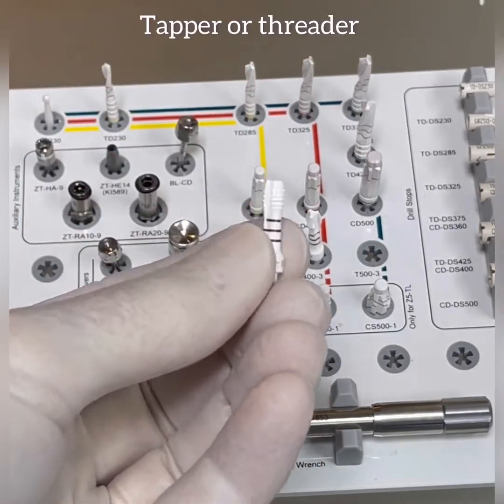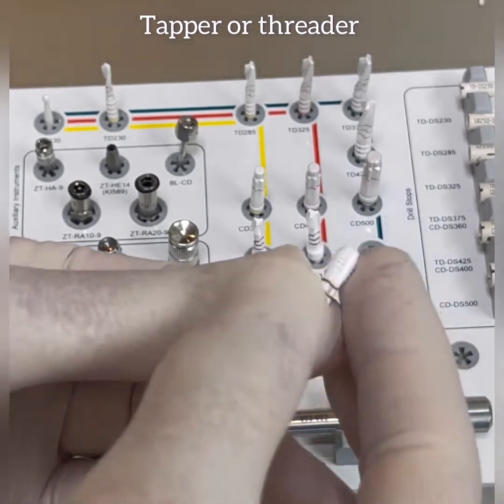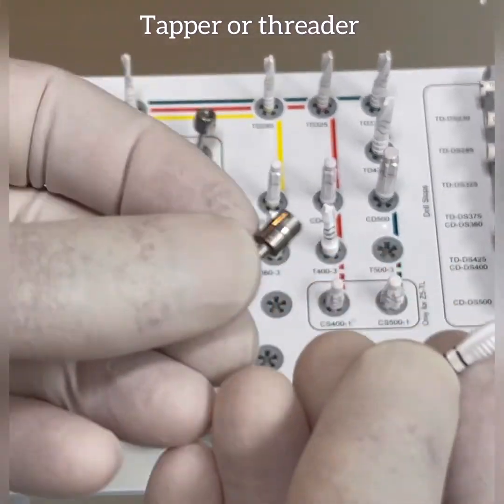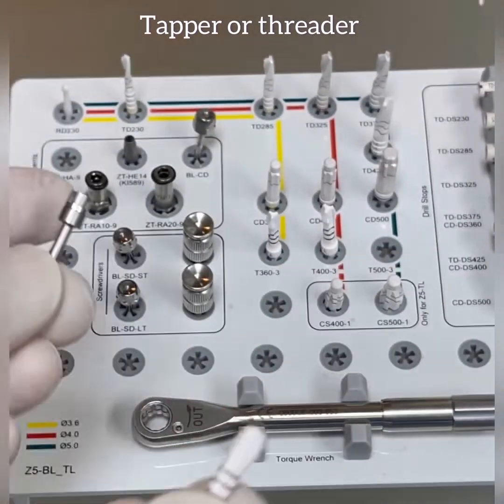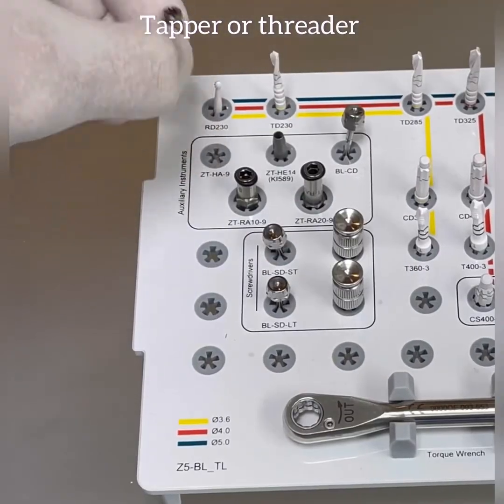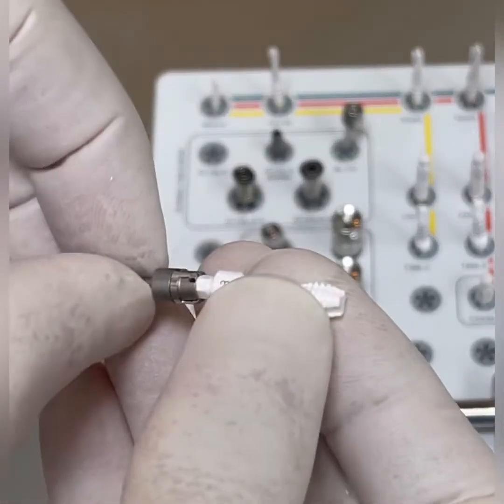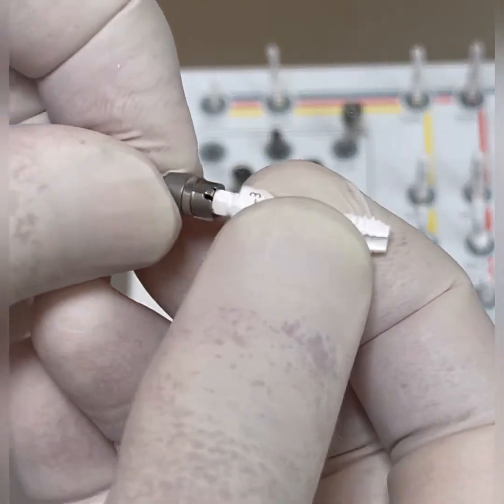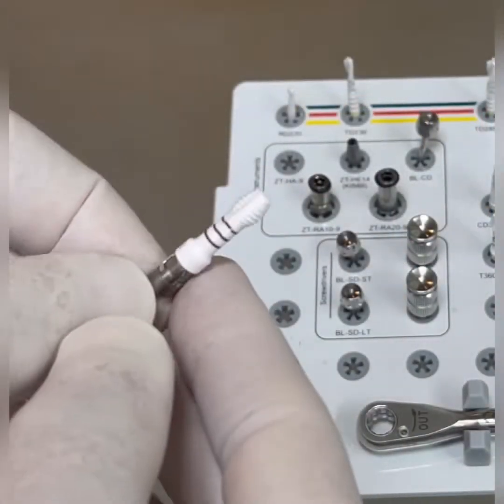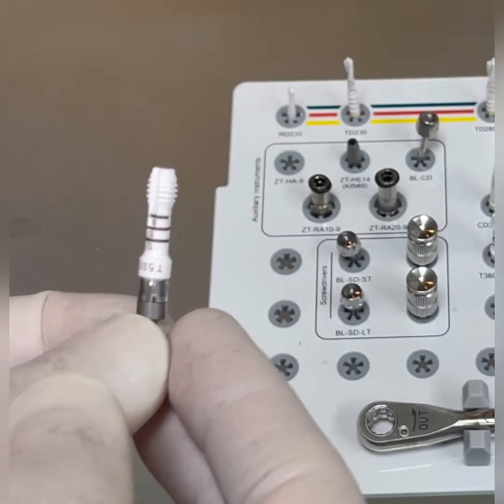This is the tapping drill, and it's used with this adapter — the ZTH-A9 adapter. It's got a hex inside. The tapper is used at a speed of 15 to 20 rpms.